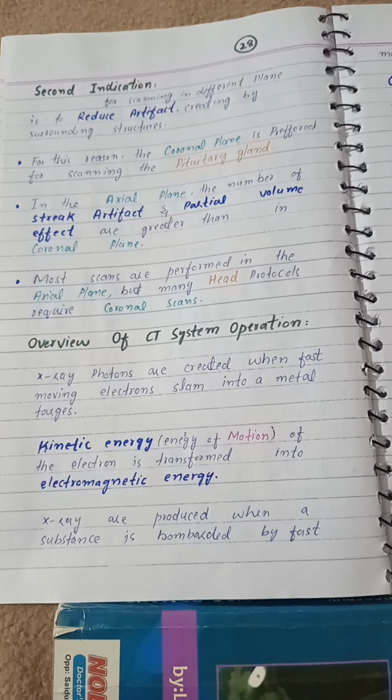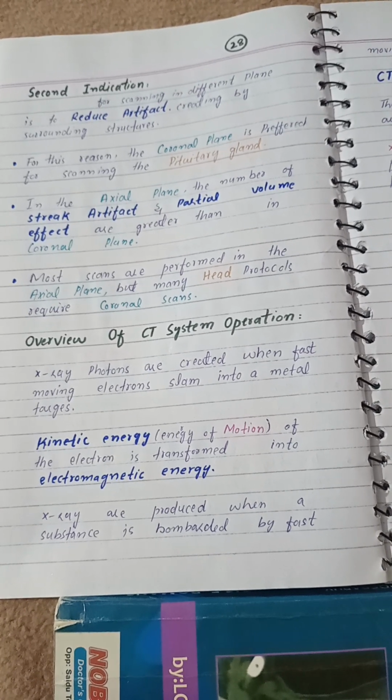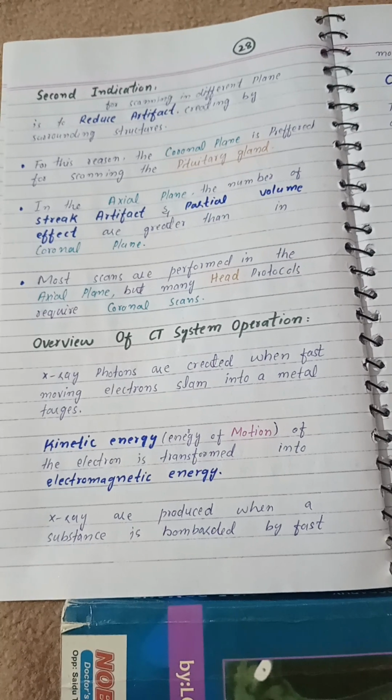Overview of CT system operation. X-ray photons are created when fast-moving electrons slam into a metal target.